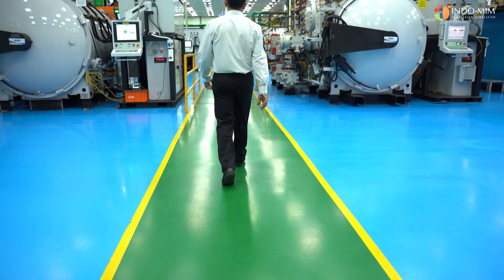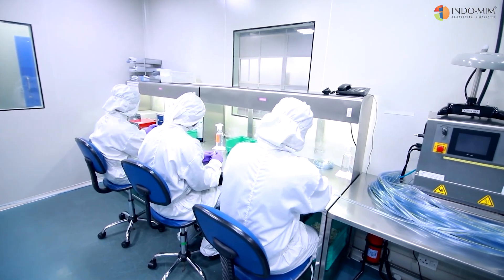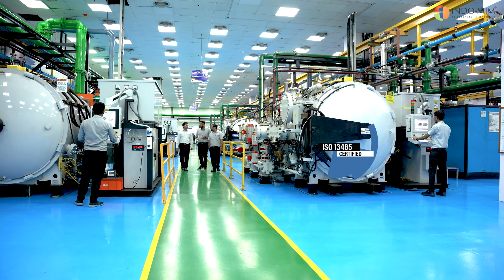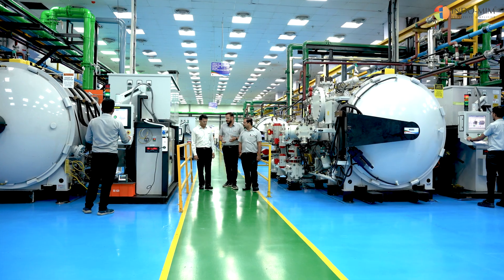IndomIM is well equipped with all the resources, including Class 7 and Class 8 clean rooms, to produce the best quality parts for the medical industries. We follow ISO 13485, which is a comprehensive quality system to produce any medical device parts.